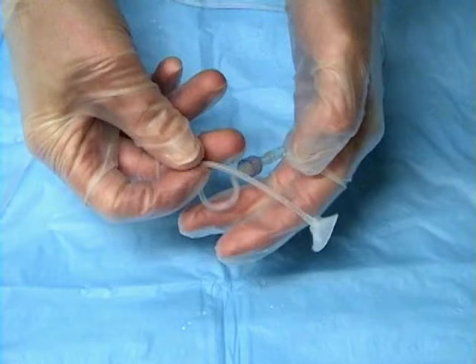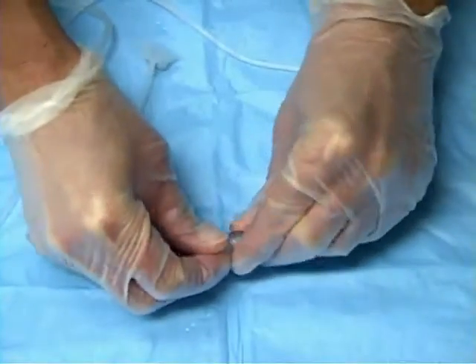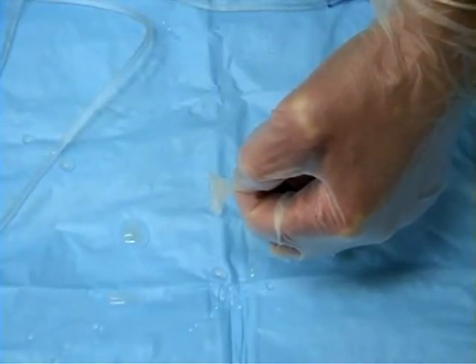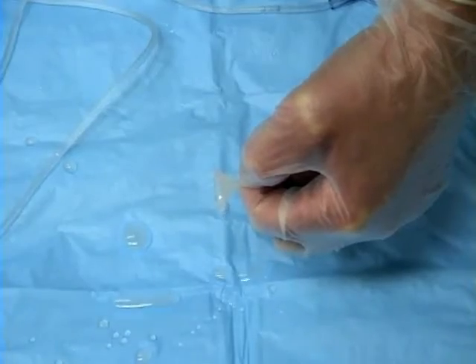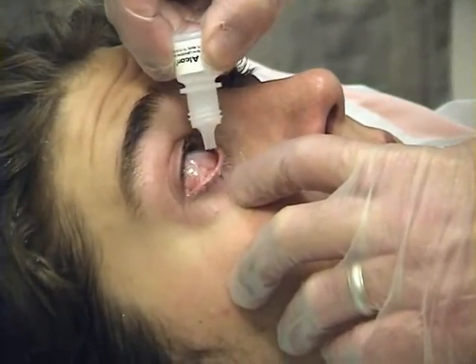The Morgan lens may be used in cases where prolonged irrigation is required. Attach the lens to the saline tubing, then open the wheel clamp so fluid flows through the device. Remember to apply a topical anesthetic to the eye prior to insertion of the lens.